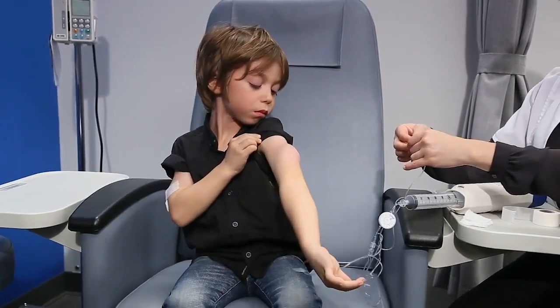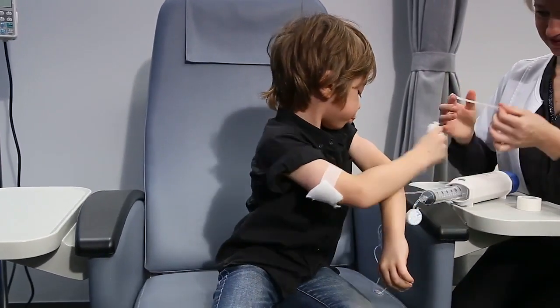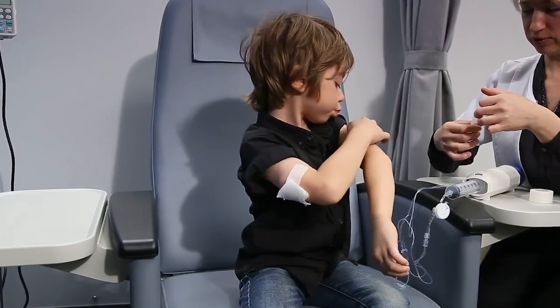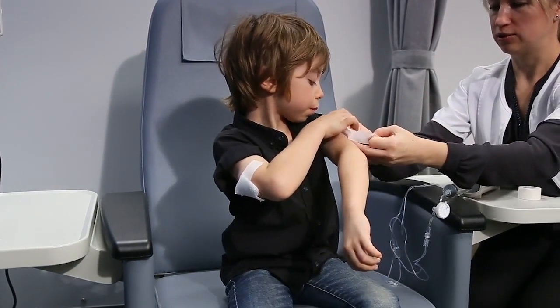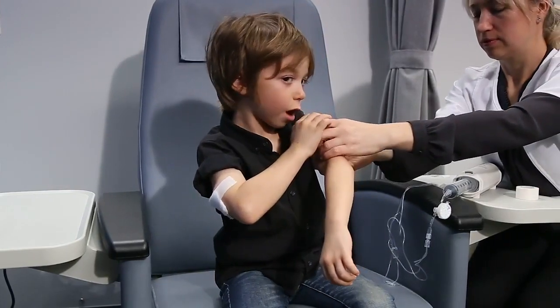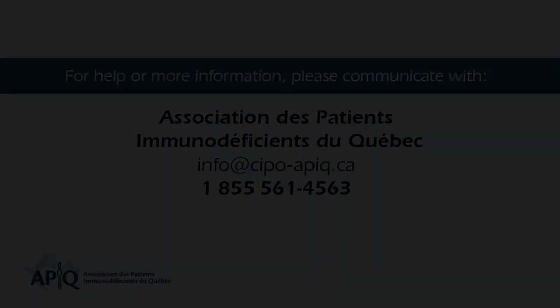Log your infusion in your treatment log as instructed by your treating team. You can use the lot number stickers that you located on the pre-filled syringes. Well done — you have completed your first infusion!